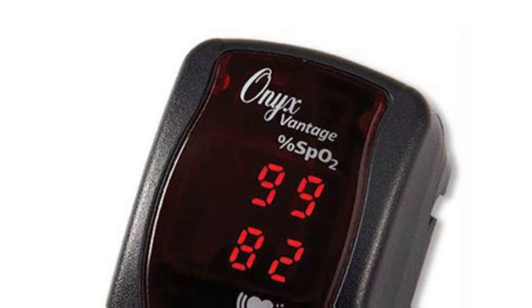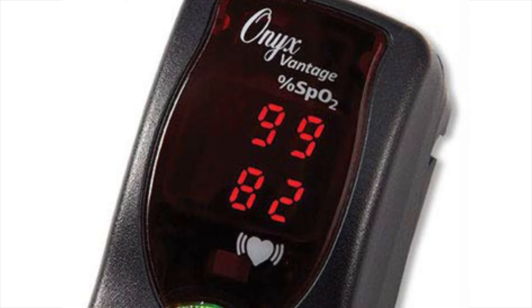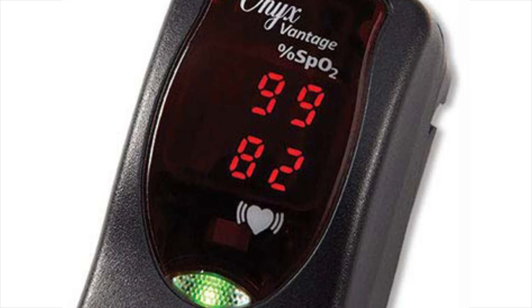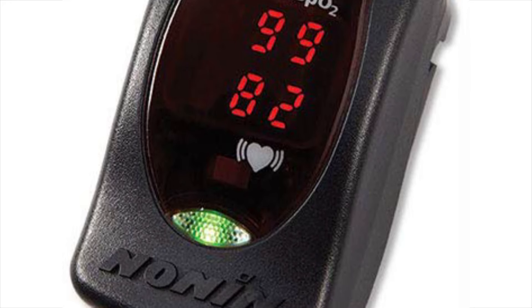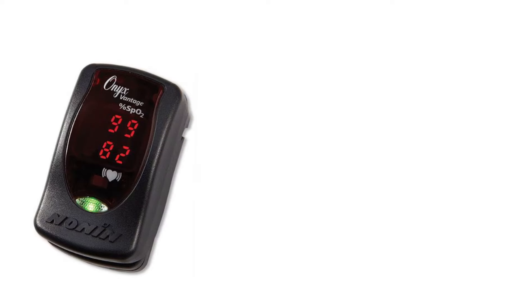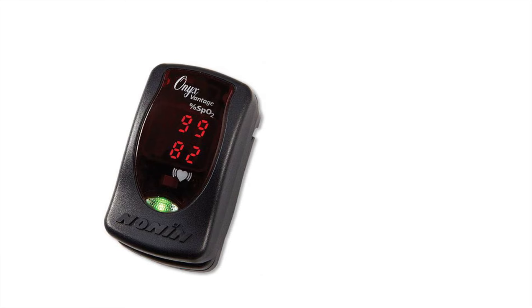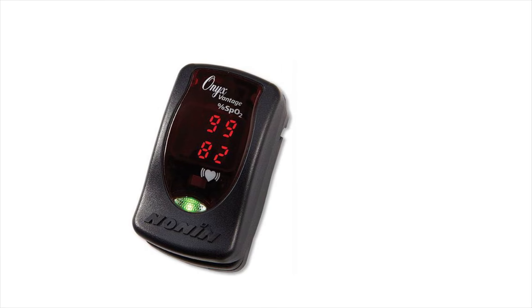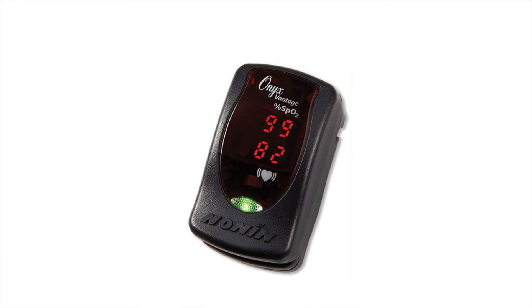Additionally, it claims to work well with all skin tones, including patients with poor circulation and those wearing fingernail polish. However, studies have found that pulse oximeters can sometimes overestimate oxygen levels, especially in very sick patients and those with darker skin tones. This highlights the importance of using pulse oximeters as a tool for monitoring oxygen levels rather than relying solely on their readings, especially in critical medical situations.